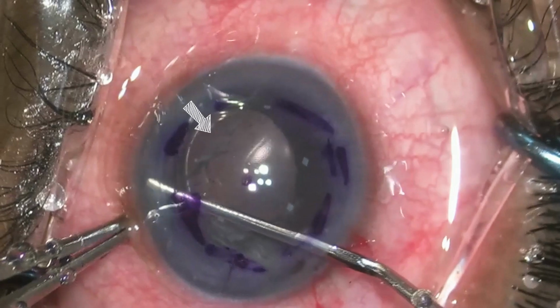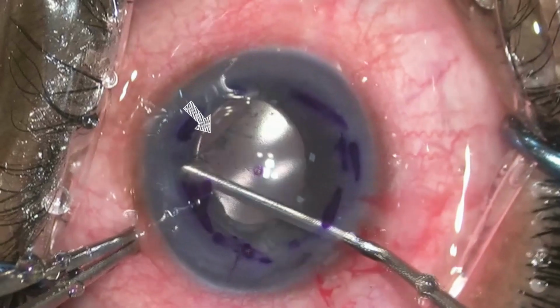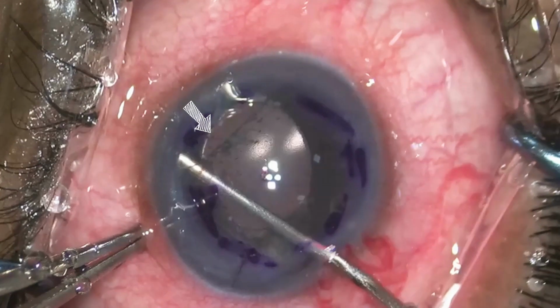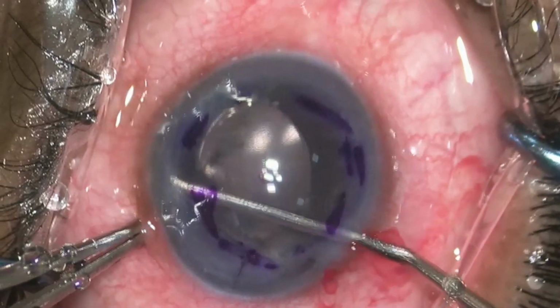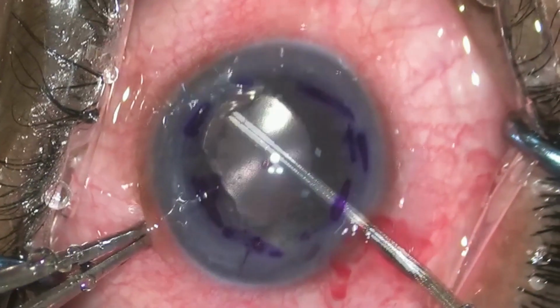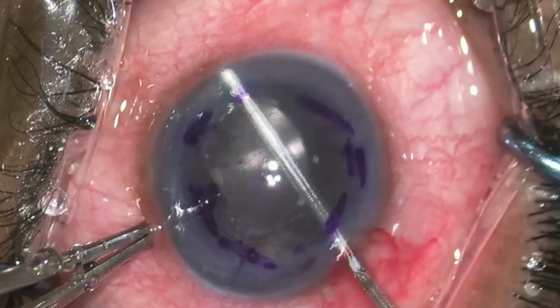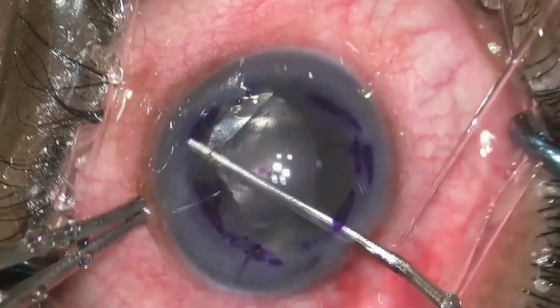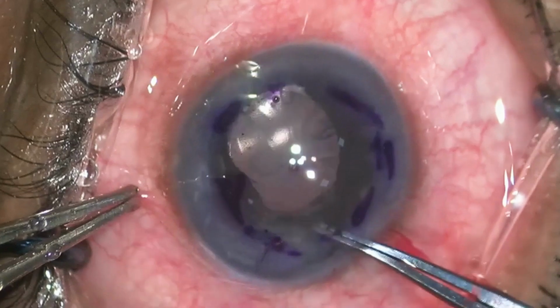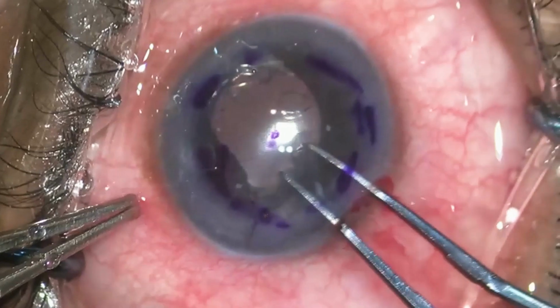A transparent membranous structure with pigment deposits is noted, which is attached to the iris and is identified as detached Descemet membrane. Stripping of the detached Descemet membrane is done. Remnants of the Descemet membrane are removed using Utrata forceps.